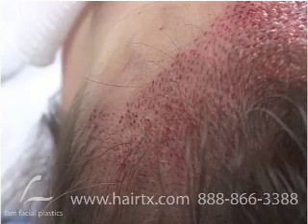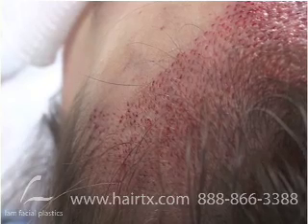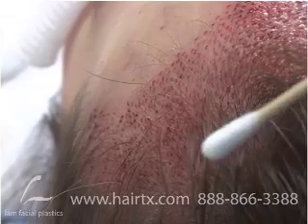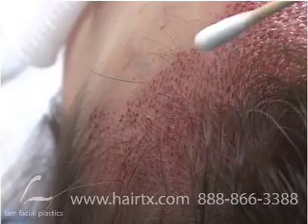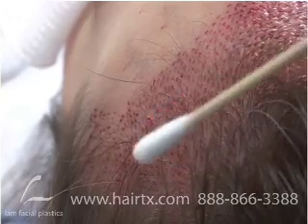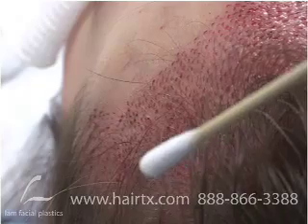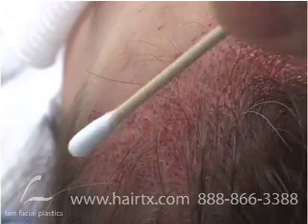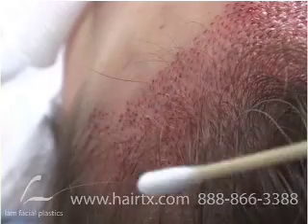We are finally at the left side of the hairline, and this is completely different from the other. Remember I said earlier that we don't want to go anteriorly, but there's always a point of turn where the cowlick starts to move in this direction. And so you can see these are actually facing anteriorly because you have to transition from the cowlick going to the side to going forward and then sweeping to the left on this side. So it's actually sweeping downward.